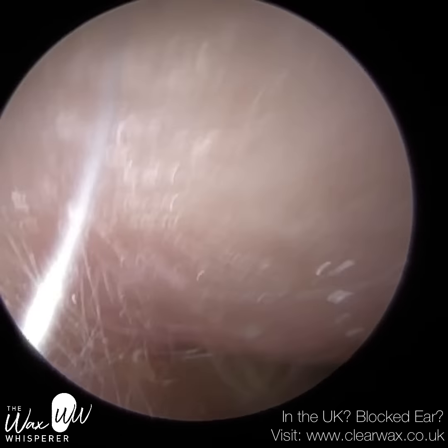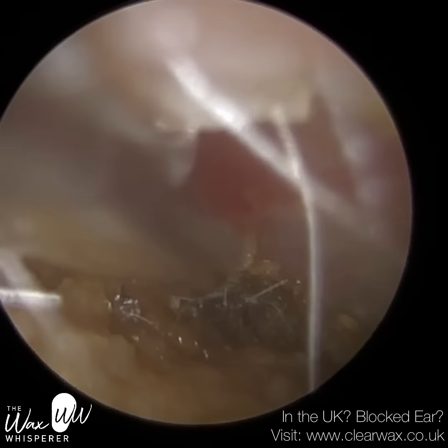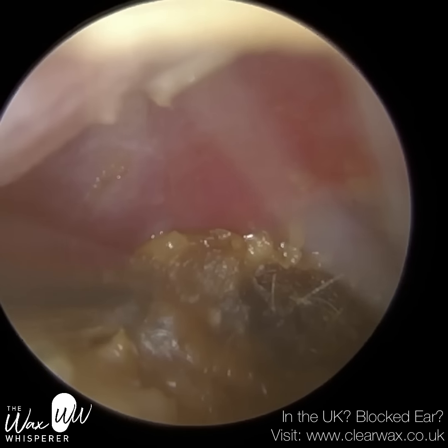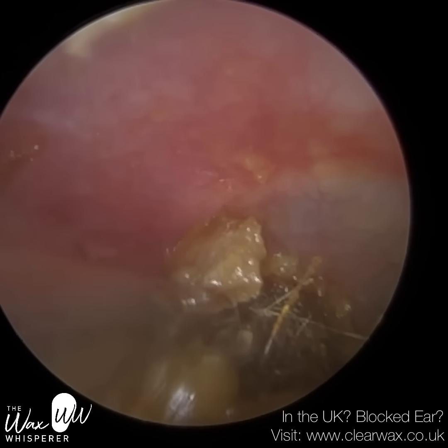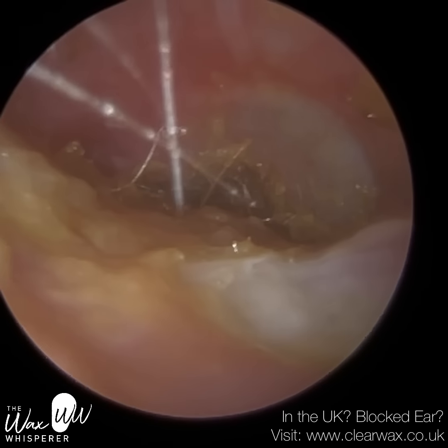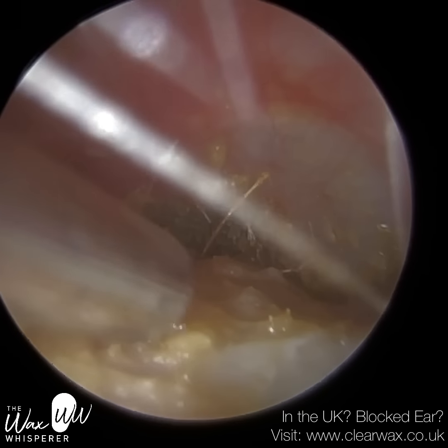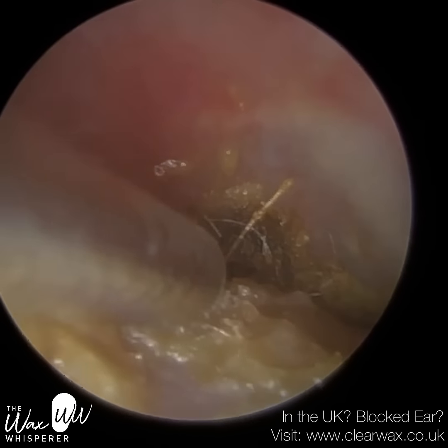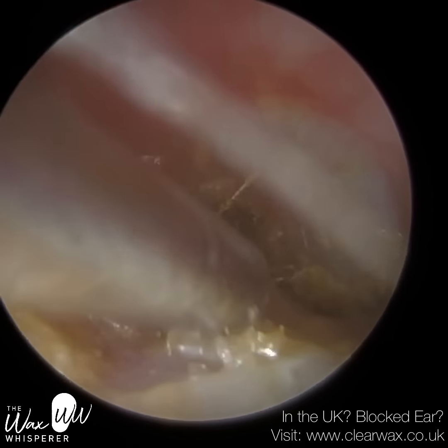If I was using a microscope, or indeed the wax scope — the other device I've developed — because of the optics of an ENT microscope or the wax scope, sometimes it's not even possible to view inside the anterior recess. With an endoscope, the optics are completely different because the endoscope is inside the ear. We can manipulate and maneuver the endoscope lens, and because it's in the ear, we can see into these little alcoves and dips and crevices. It's a lot more difficult to do that with magnifying loops, ENT microscopes, or indeed the wax scope — and that's why an endoscope, for earwax removal, I feel is the most superior method because of the optics it provides.